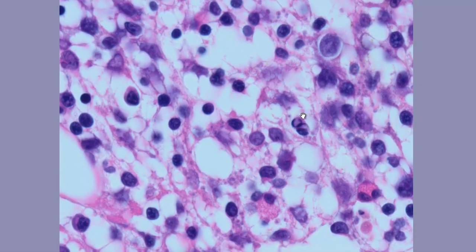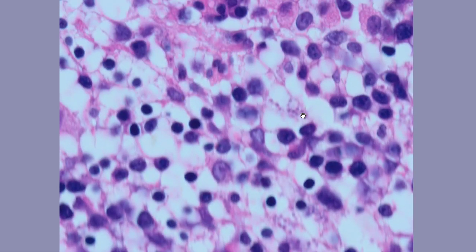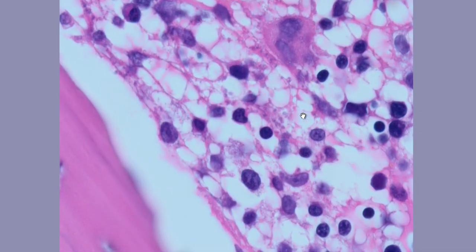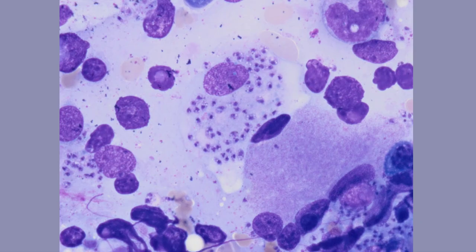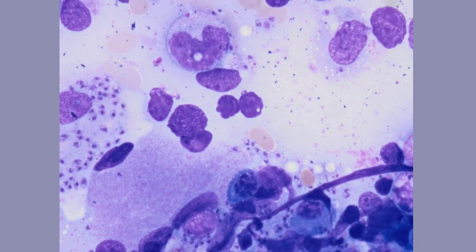smears by viewing them. You can see that there are so many of them. Small round bodies. Stuffed macrophages. There they are. And they've got eccentric nuclei. And when you examine the aspirate, you can see both intracellular and extracellular.